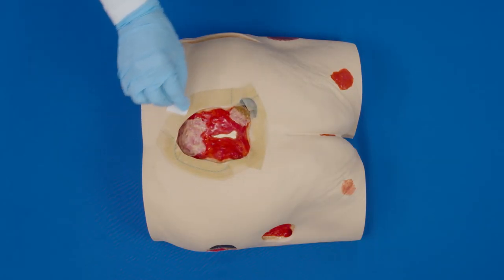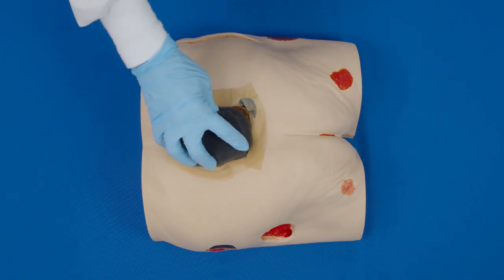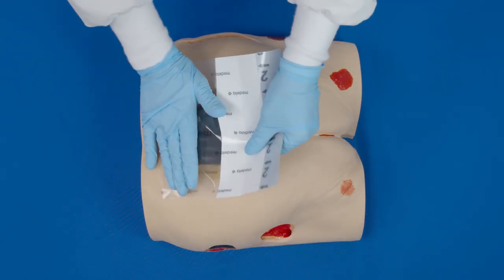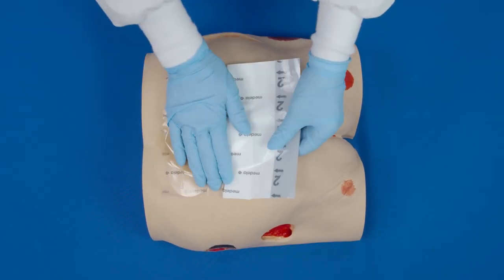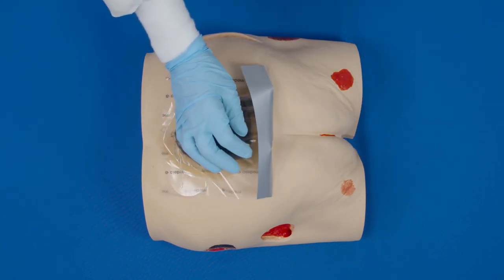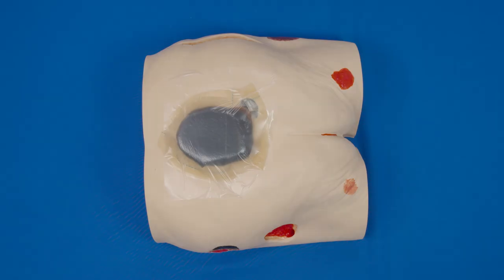Remember to use skin prep under and on top of the strips, then cover the wound with the transparent film. The transparent film will stick very well to the hydrocolloid strips.